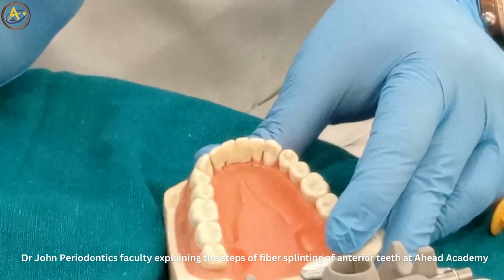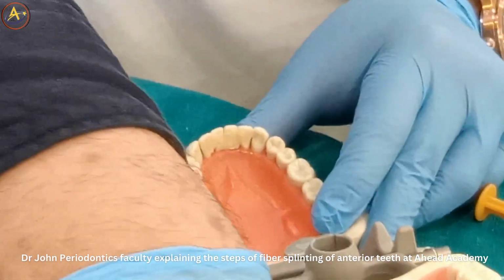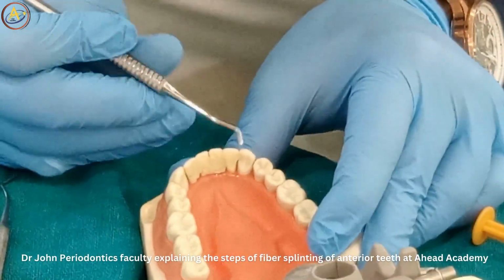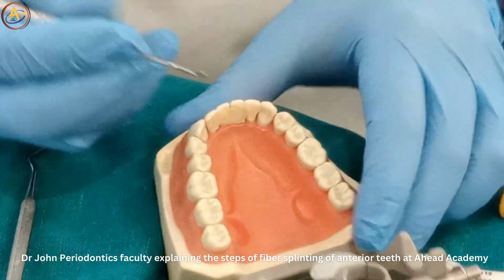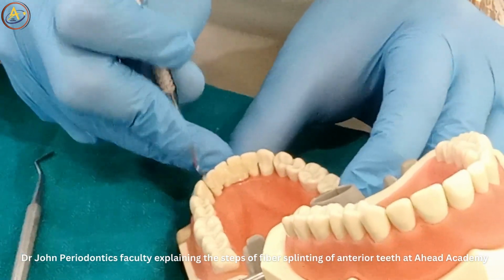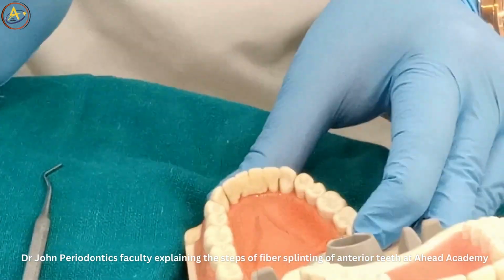Now this is just the initial filling. Okay, now what we'll do, you have to trim this. Why trimming is important, I'll show you. If you don't remove this coronal part, the patient will have a high point of occlusion, he will have the opposing point, so you have to clear the coronal clearance. Remove as much of the coronal part as you can, first of all.